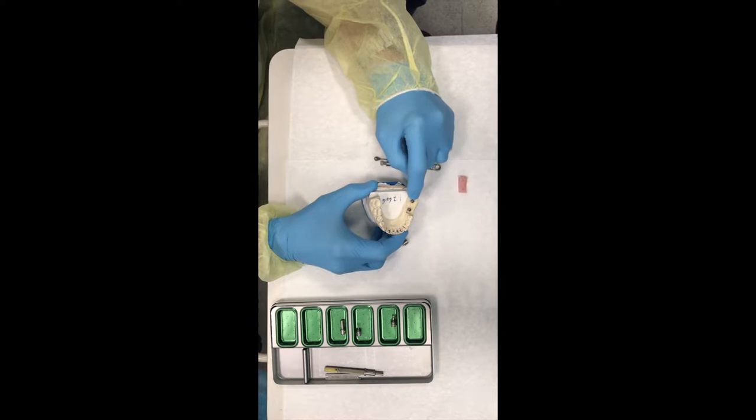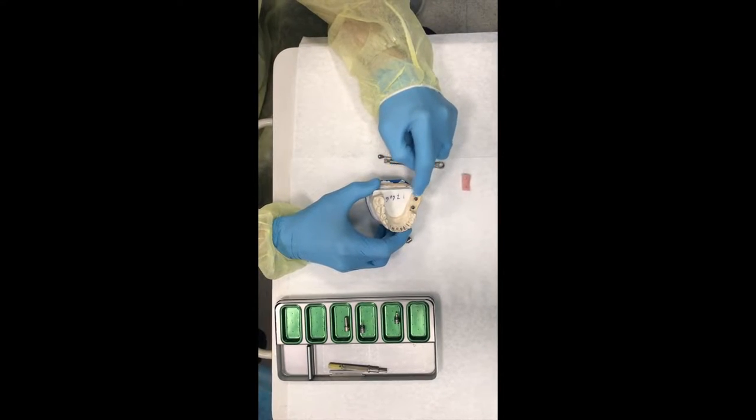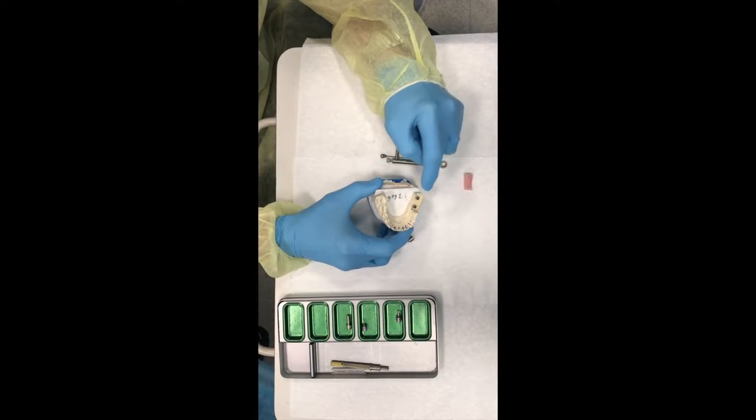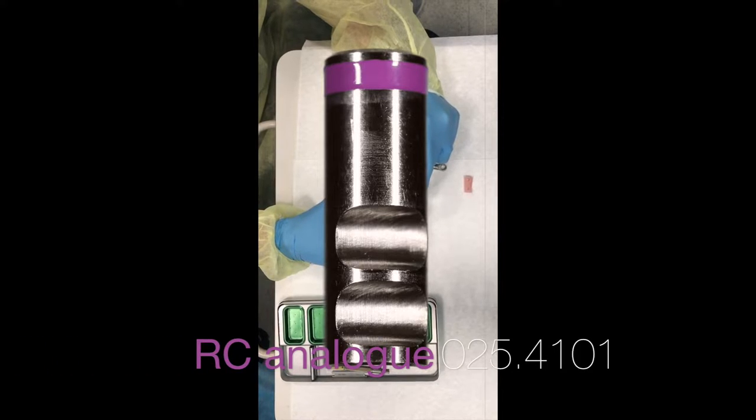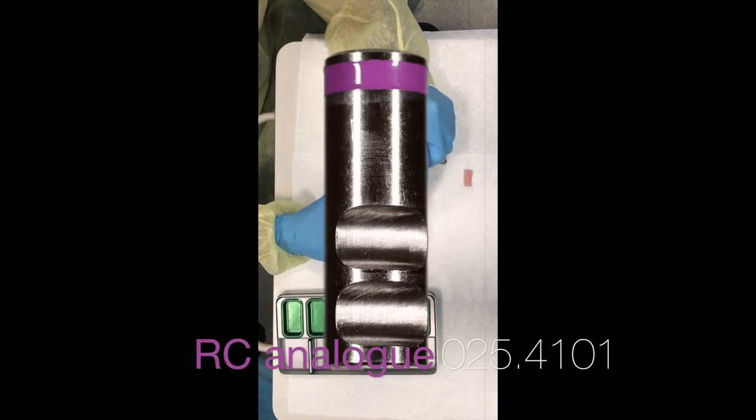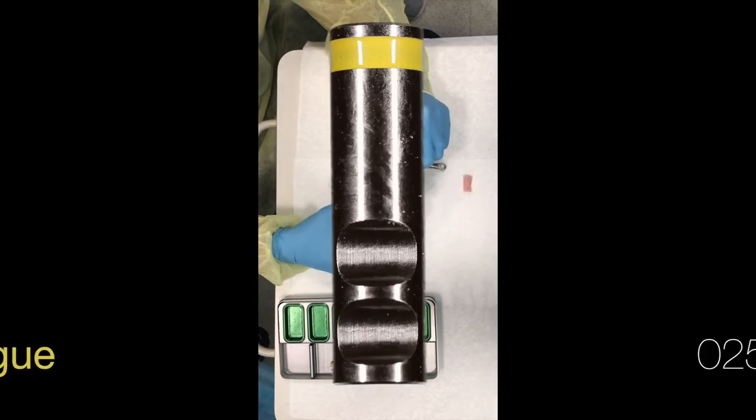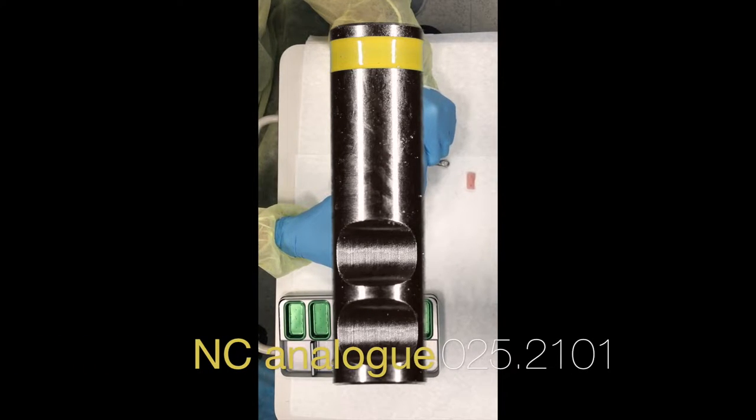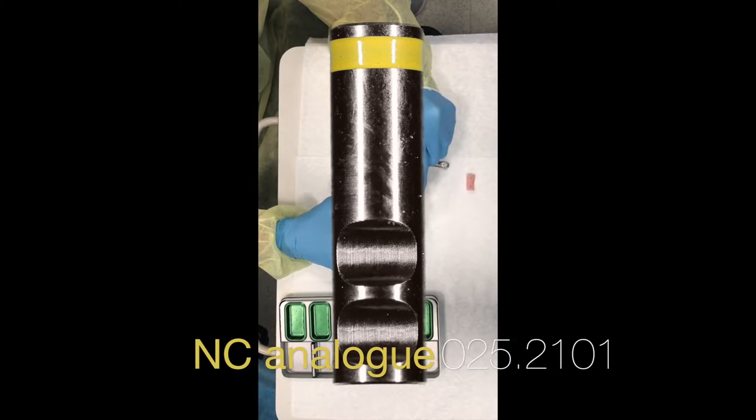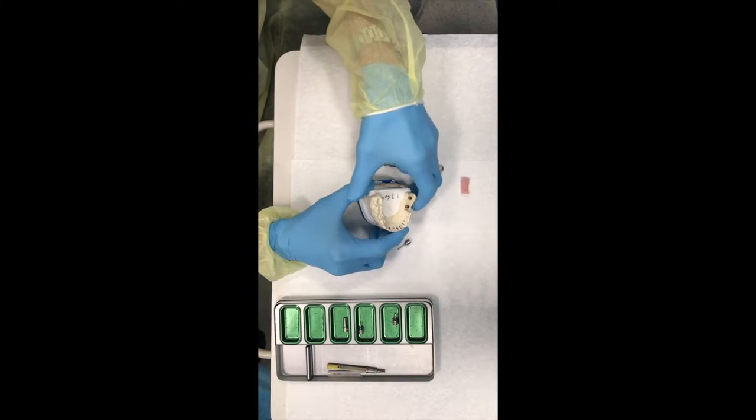RC meaning regular connection versus a narrow connection. Whether the implant is 4.1 millimeters or 4.8 millimeters, it still uses the same exact analog. The NC is a yellow stripe, the RC is a purplish sort of lavender colored stripe.